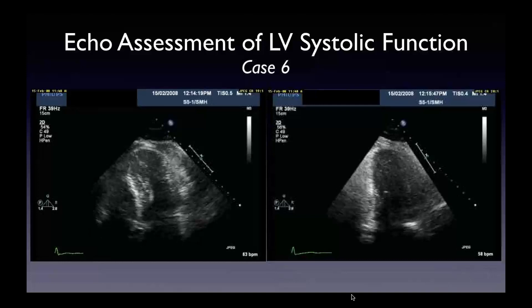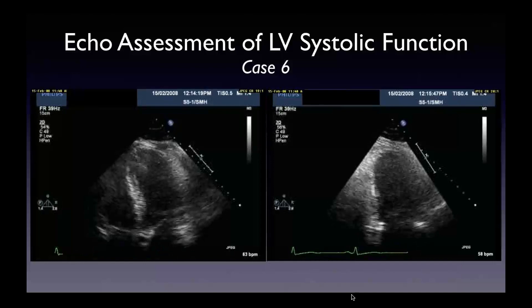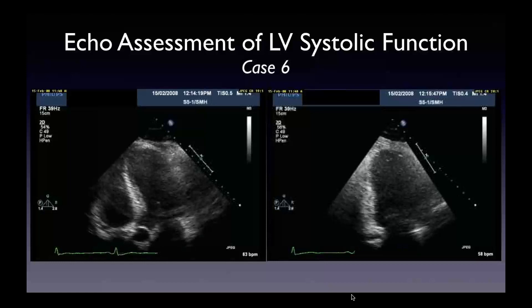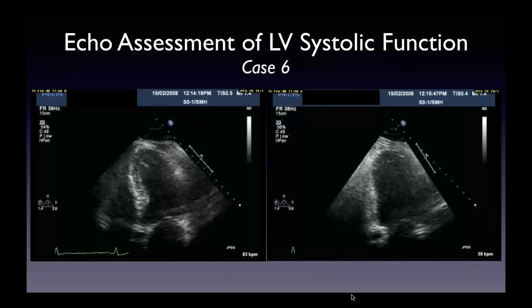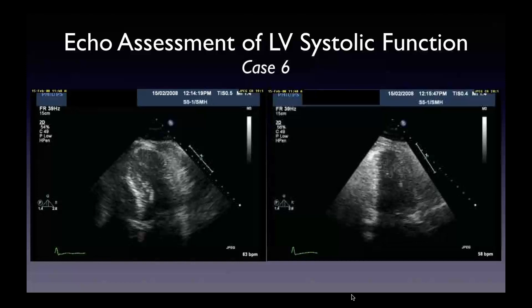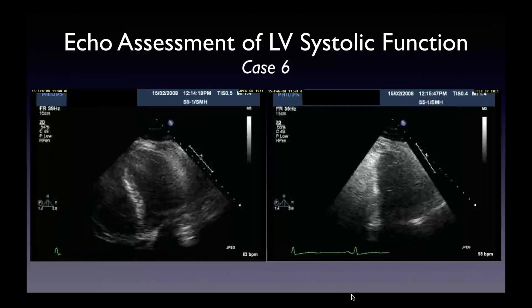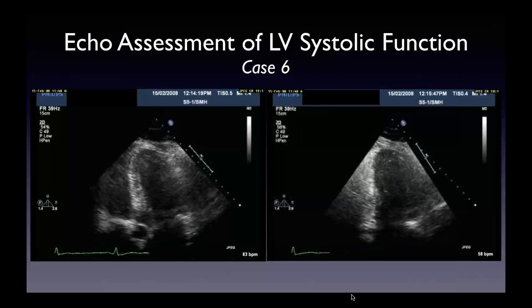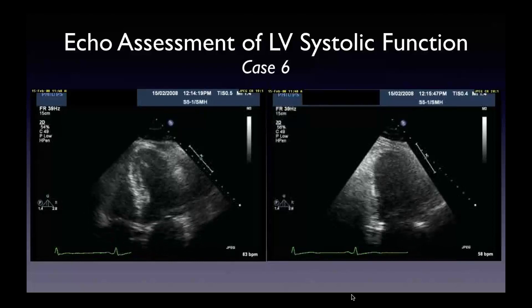You can see foreshortening of the apex in the two-chamber view compared to the four-chamber view — the length of the left ventricle is significantly shorter in the two-chamber view. Overall, most would say LV ejection fraction looks normal with no clear wall motion abnormalities. We would include a statement that subtle wall motion abnormalities cannot be excluded because of poor endocardial definition.